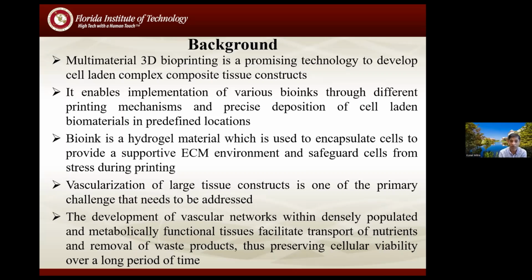And we can use different types of biomaterials, which will simulate the different types of tissue characteristics. Like we all know that the extracellular matrix of different tissues varies. So based on the different types of biomaterials and different types of cell combinations, you can create that architecture quite convincingly compared to maybe a traditional 2D culture.